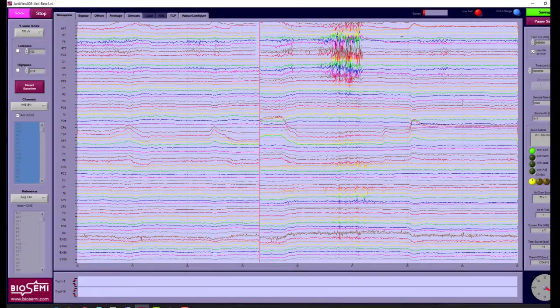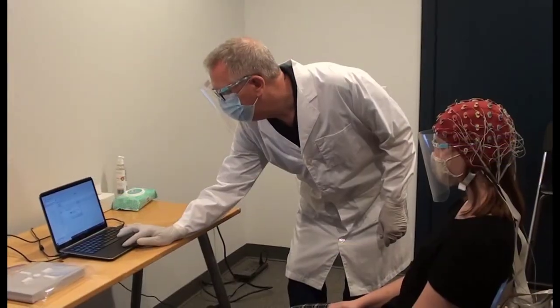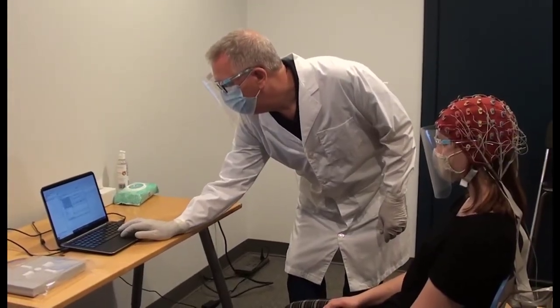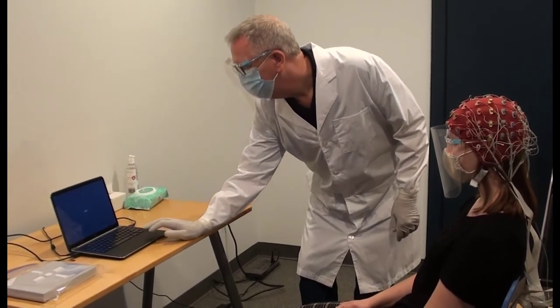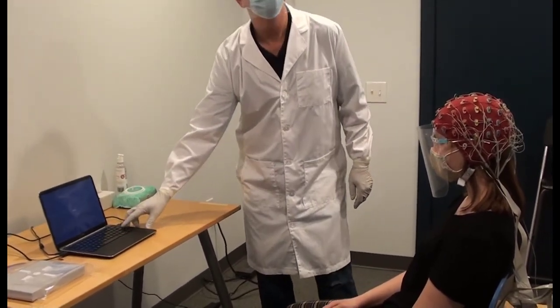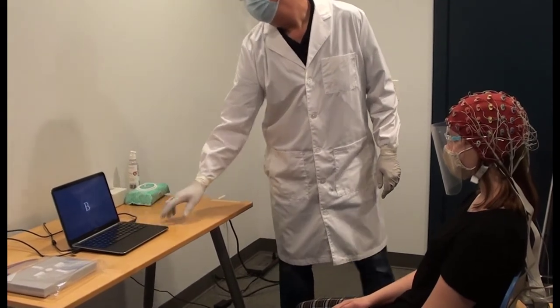After the EEG recording has started, if you're doing an EP or ERP experiment, you will need to set up and start the stimulus. Often, written instructions are presented to the subject at the beginning of the experiment. Otherwise, provide verbal instructions.